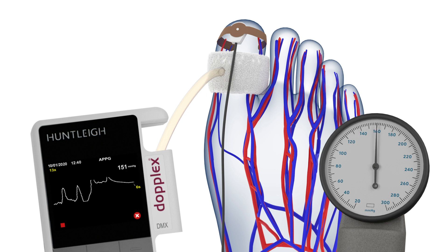Inflate the cuff slowly until the pulses disappear. Then deflate the cuff at 3 mmHg per second by keeping the white line within the green band.